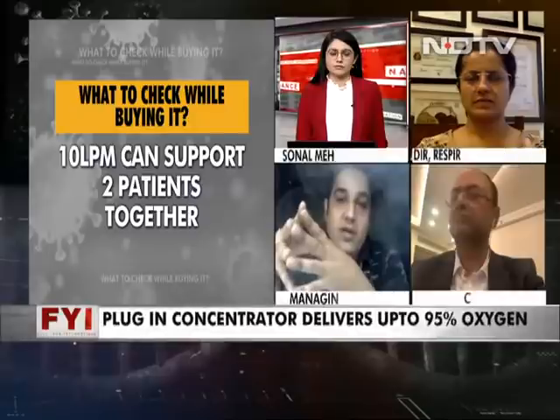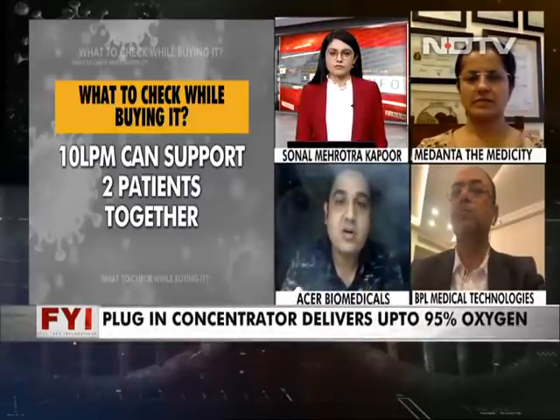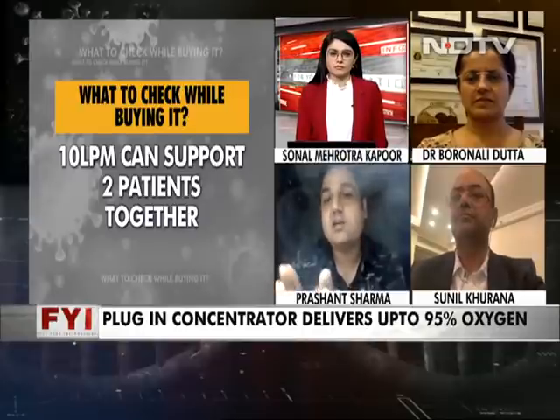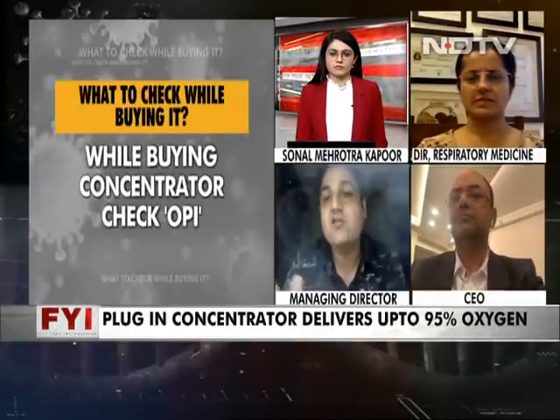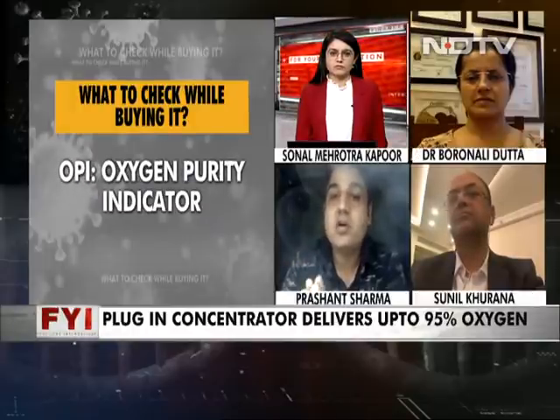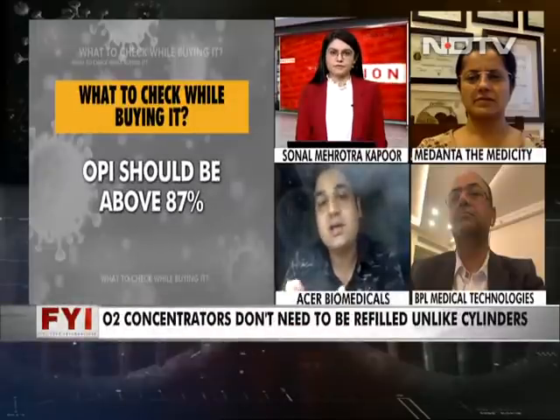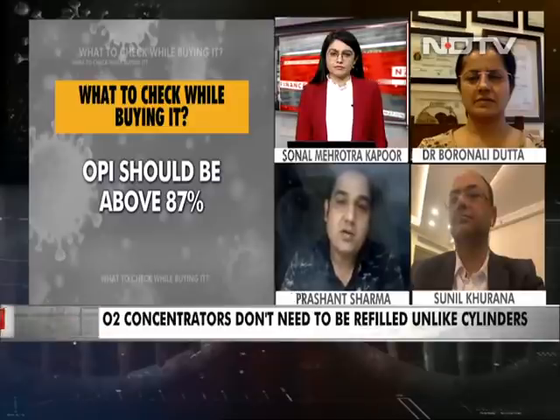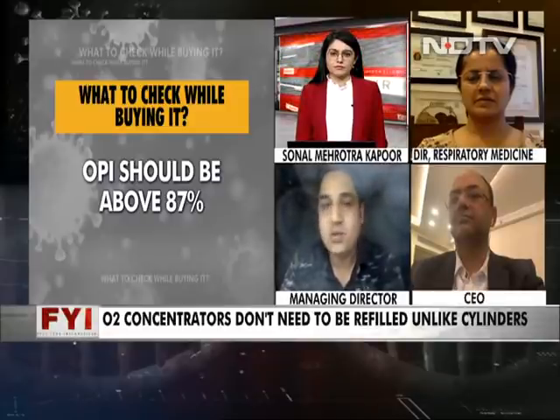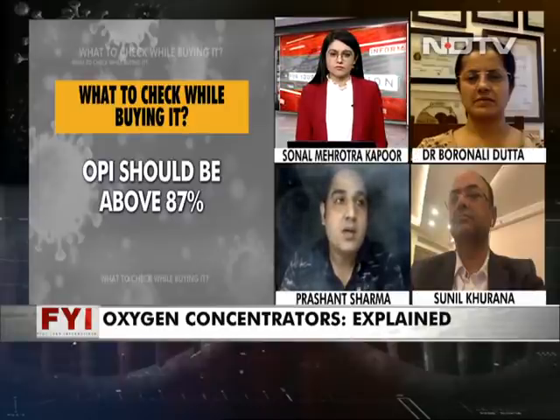When we talk about medical concentrators, if we are using a product at a flow rate of 5 liter per minute and the product has a capacity of 5 liter, it should deliver oxygen which has a purity of 92 plus minus 3%. This is basically the standard. So as Mr. Khurana said, we should buy the branded products like Philips, BPL, or our product is a biomedical. We have an ABM brand name there, right?